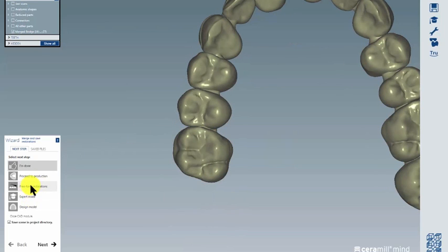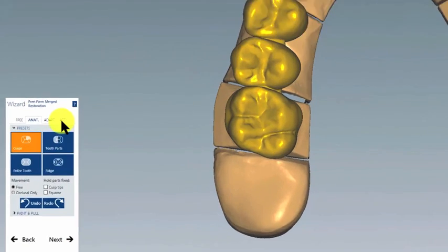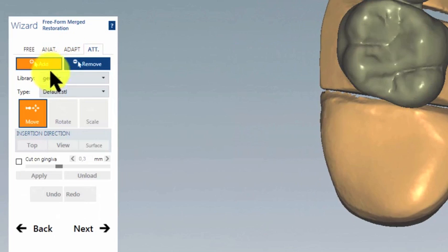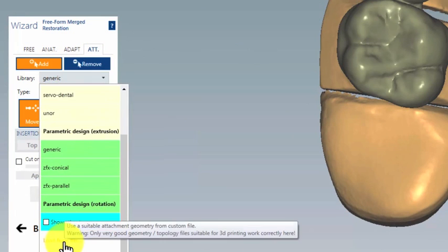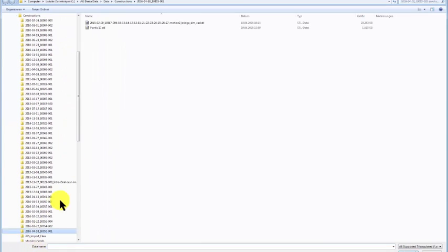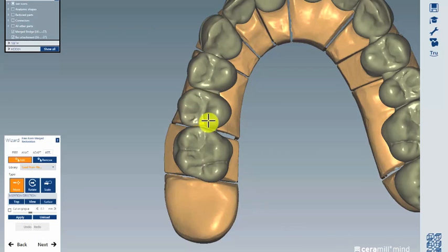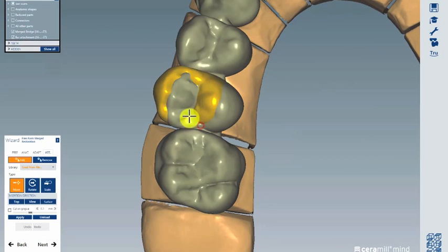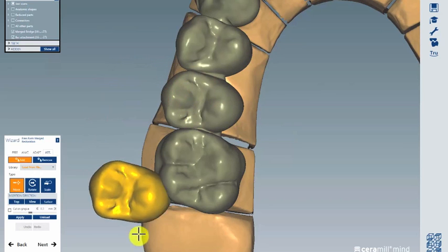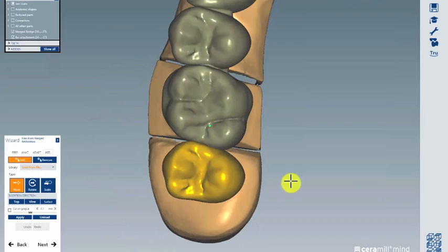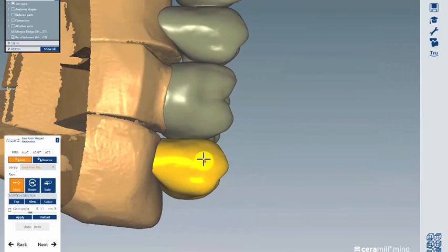Go to Freeform, Restorations, then choose Attachments, Add, In the Library, and Load from File. Click on PONTIC 1.7 and Open. At first you won't see it, but it's hidden here.